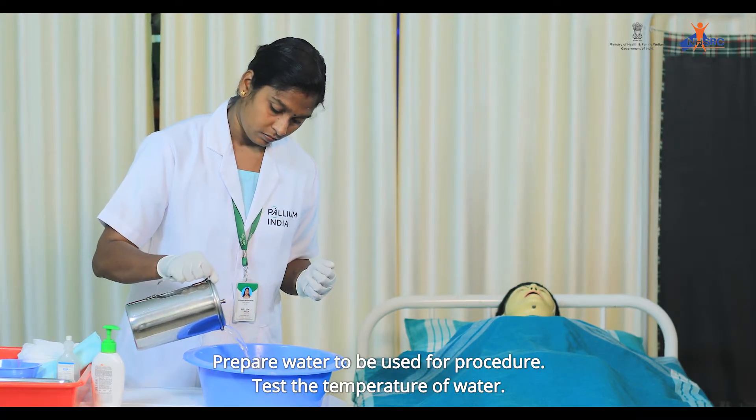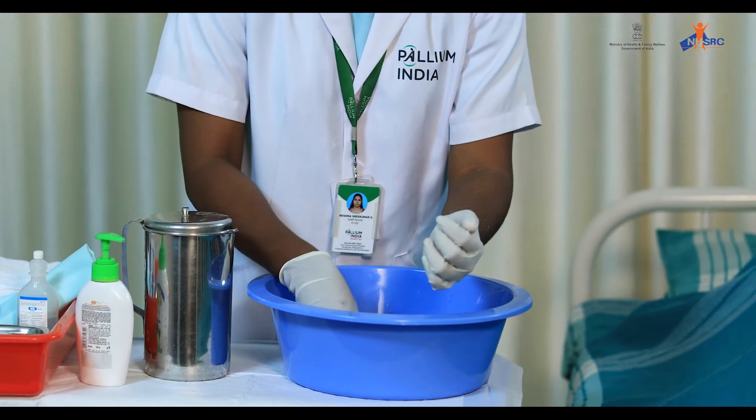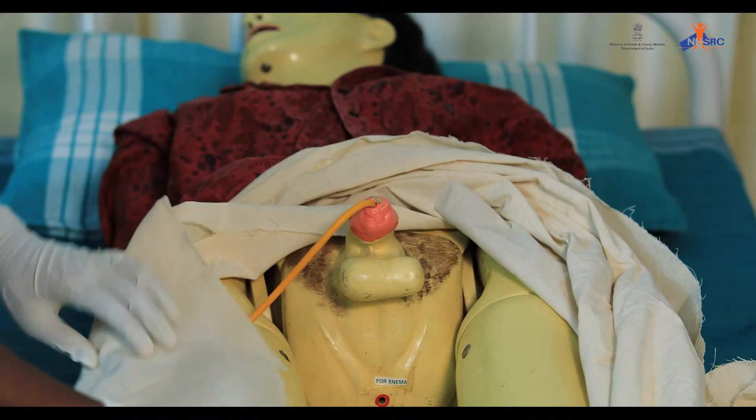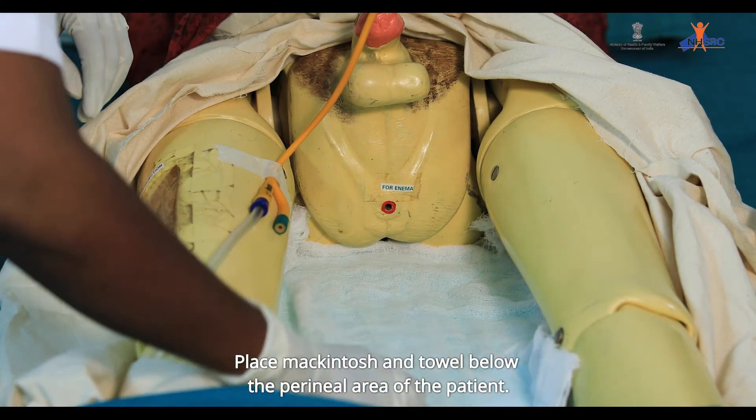Prepare water to be used for the procedure. Test the temperature of the water. Place the patient in supine position. Place mackintosh and towel below the perineal area of the patient.